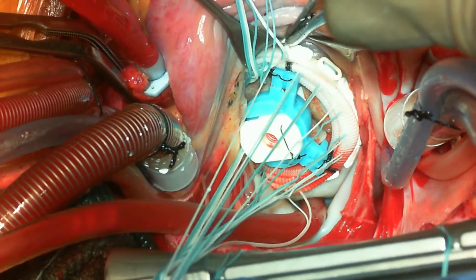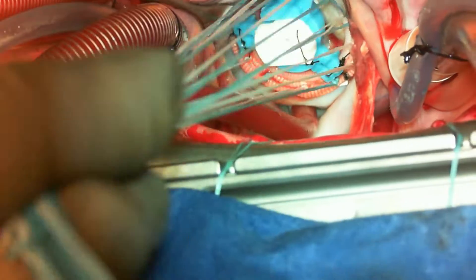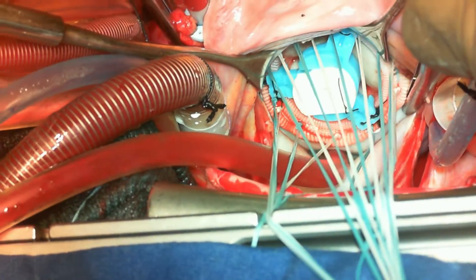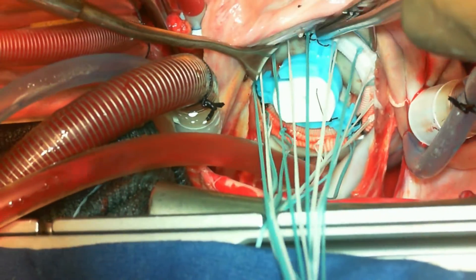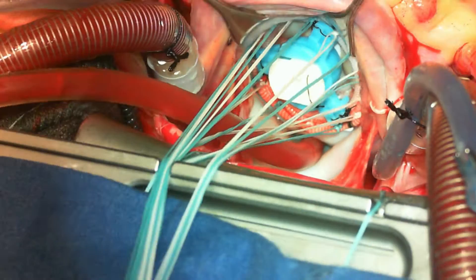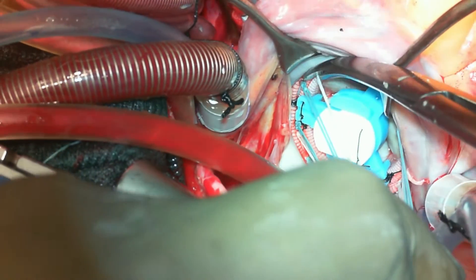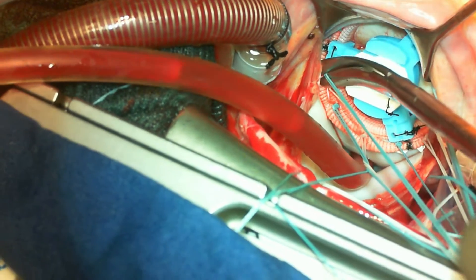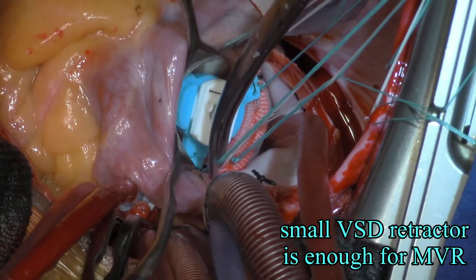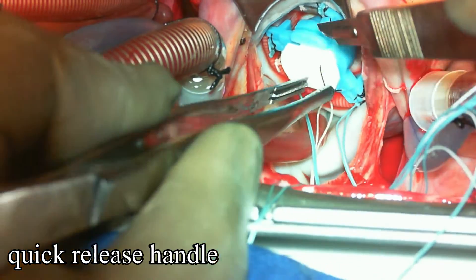With the interrupted technique, the incidence of paravalvular leak is quite less, though it takes a bit more time compared to the continuous technique. Once all the sutures are tied, it's time to divide the sutures. Each suture that is cut has to be confirmed as tied first — that is the job of the surgeon. Then the quick-release handle is released by cutting the three stitches that are holding the struts together.